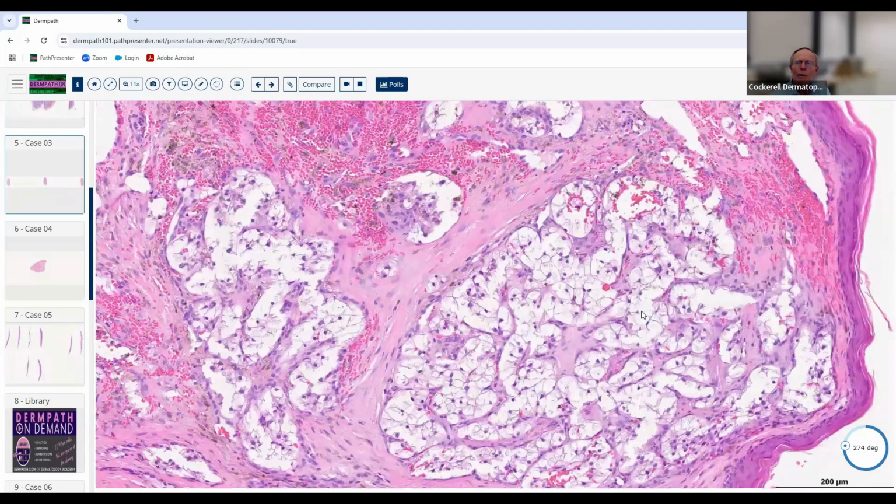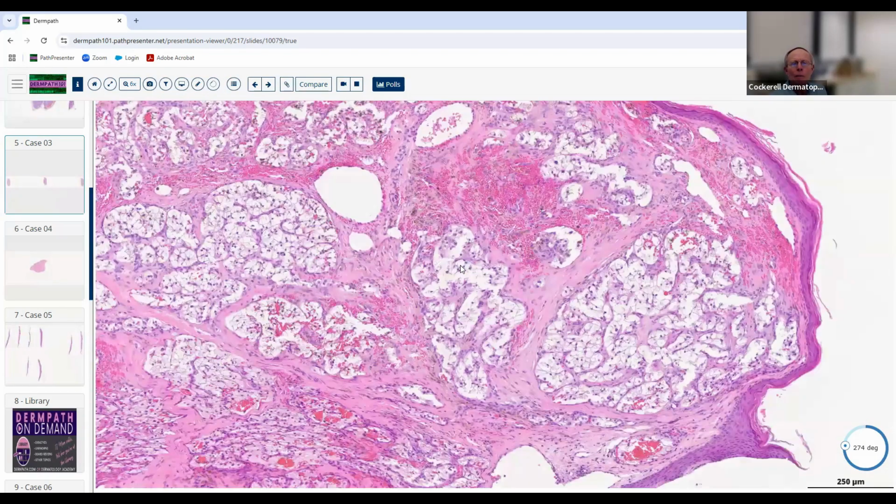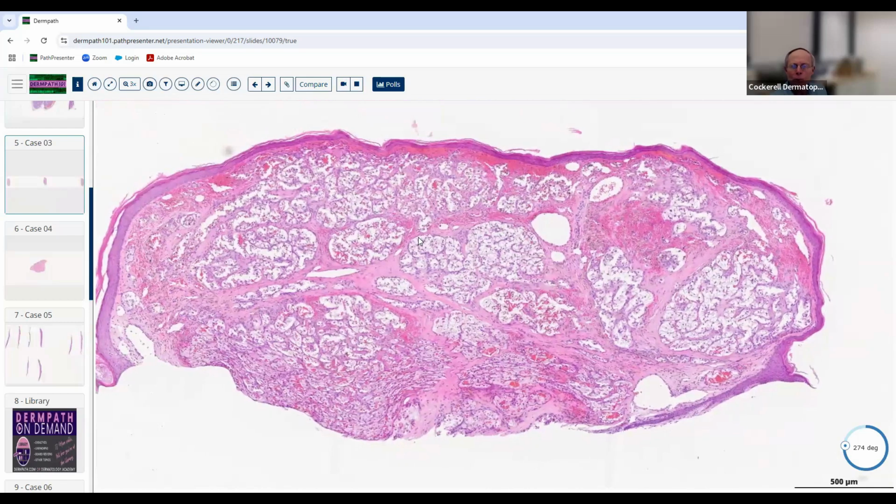And it's something that would be theoretically fair game on the board examination because it's got that characteristic clear staining cytoplasm, multiple aggregations with a lot of blood vessels and extravasated erythrocytes. So they might show you this. If they did, they probably just wouldn't throw it up there and say the best diagnosis is blank. They might give you a clinical photo and show you this and then expect you to correlate it. But it is pretty characteristic of a metastatic renal cell carcinoma.